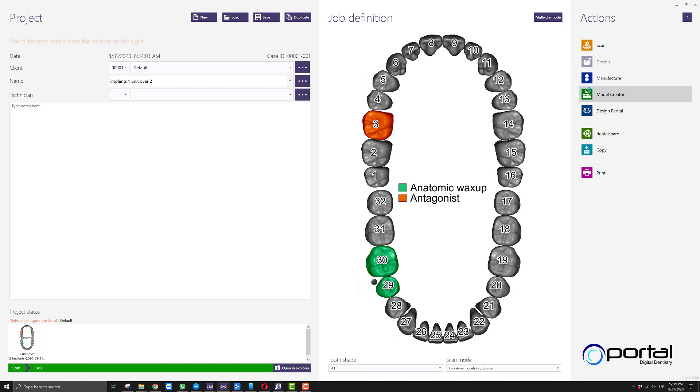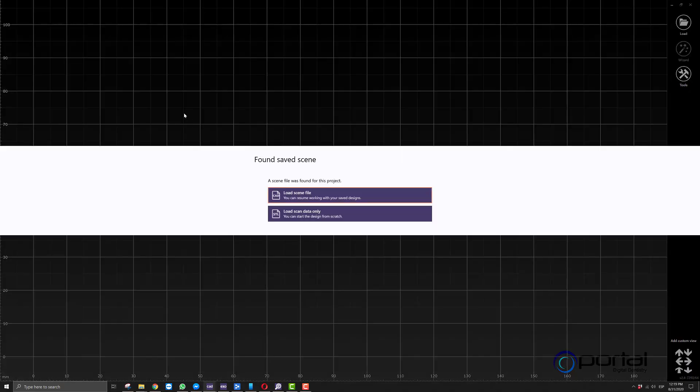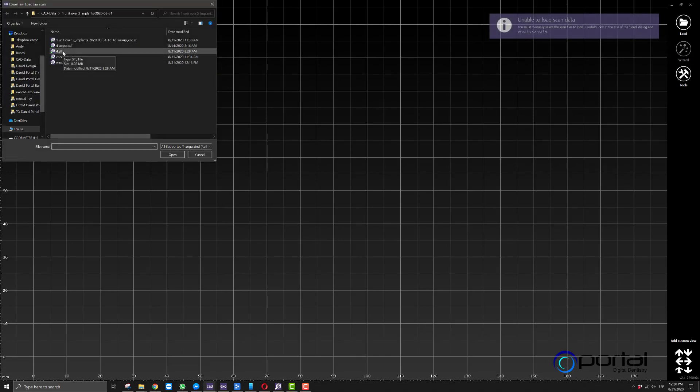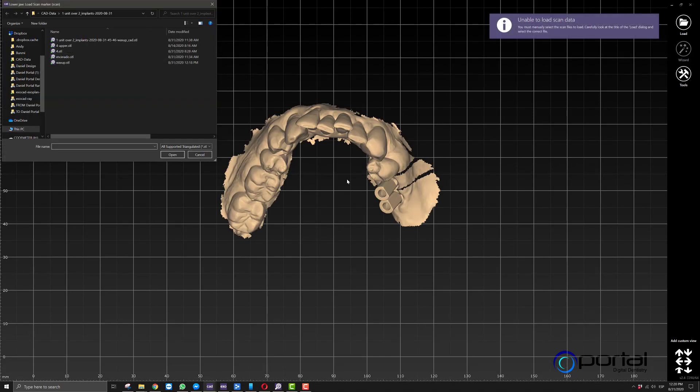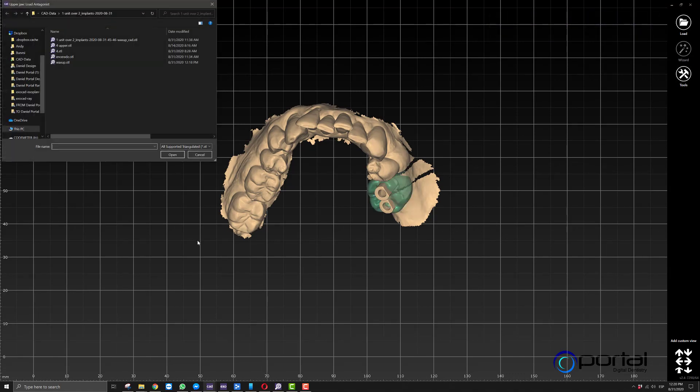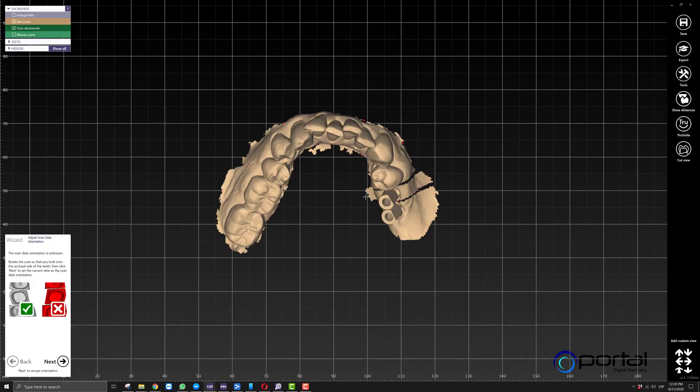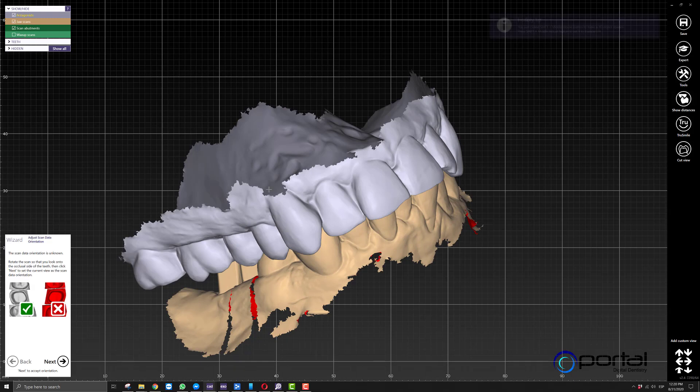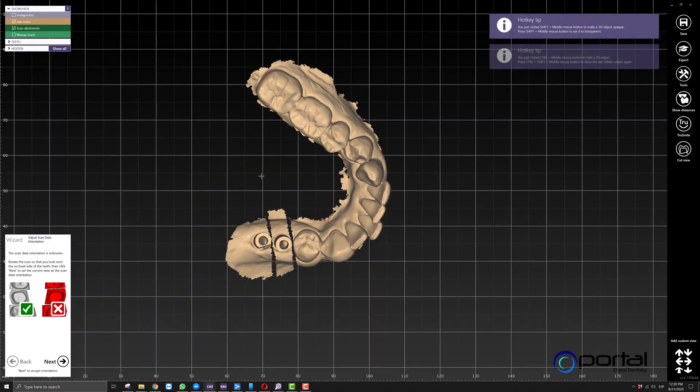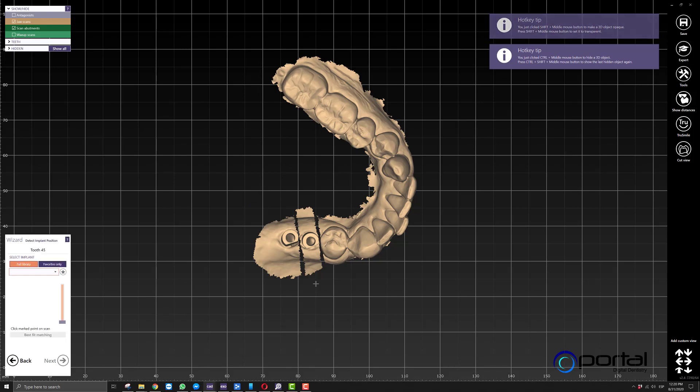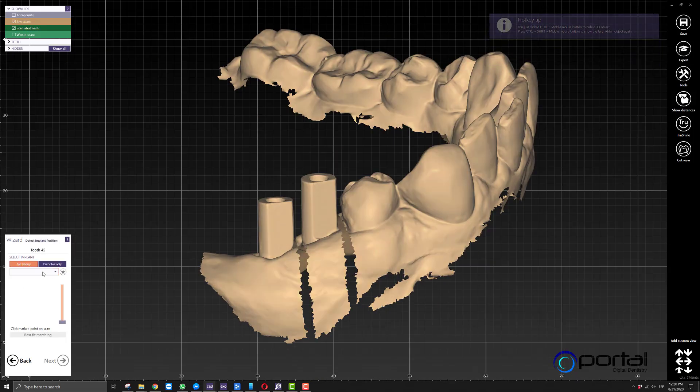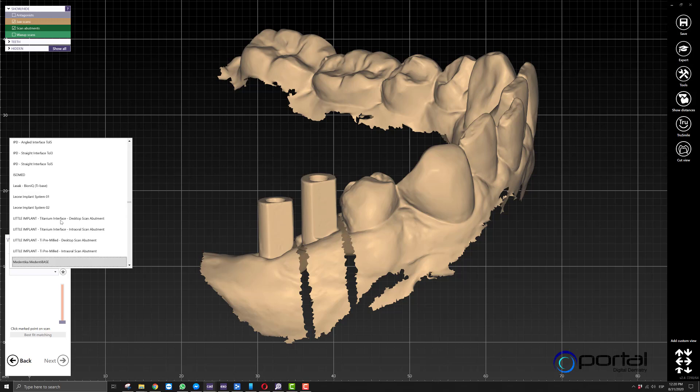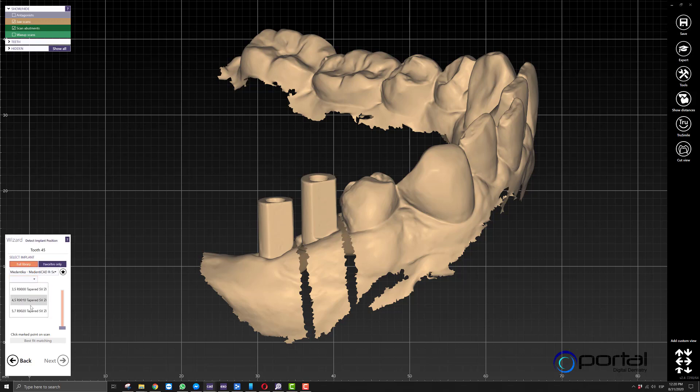We'll save our order form and move on to the design process. We'll start importing the files in the order that ExoCAD requests. First is always the working model, then the scan bodies. I'm going to use the same scan because the scan bodies are there. Now it's going to ask us for a wax up scan, so we'll import our wax up and then our antagonist. In theory, the antagonist should not be necessary because we made all those changes in the previous design, but we'll bring it in anyway.